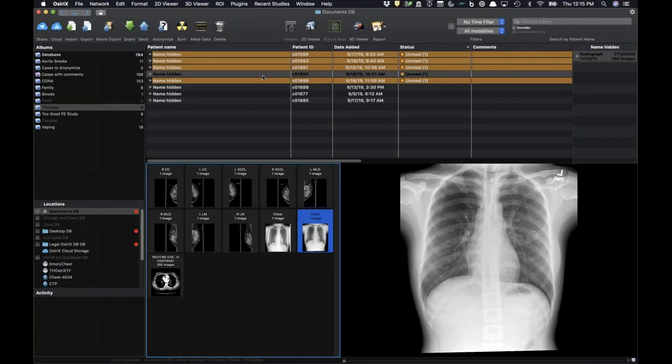Wow. Very nice. Okay. I will stop there, and Jeff, we can come back. And I do want to comment, there was no lateral done on either of those. We don't generally do laterals on younger patients in the ED.